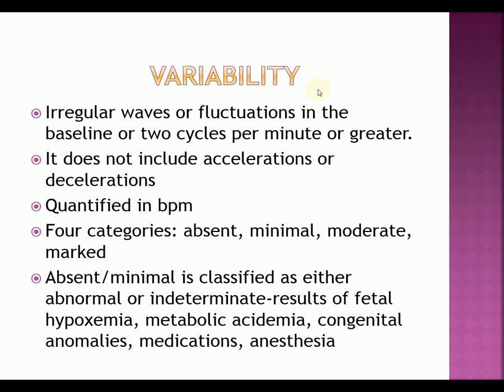But if you have a patient that comes in that has a sinusoidal pattern, it's very much indicative of anemia, possible blood loss between the fetus and the mother. So you could have a partial abruption going on, you could have hydrops going on, but it's a big major marker that your baby is becoming anemic for some reason, either through loss of blood or destroying of the fetal blood. Something's going on and that's not good.